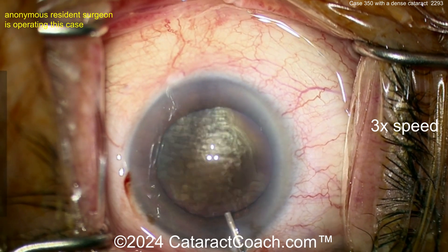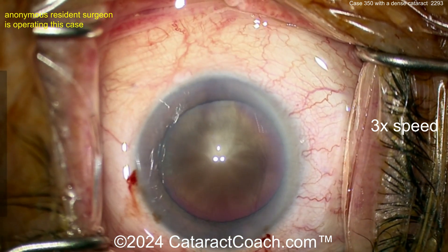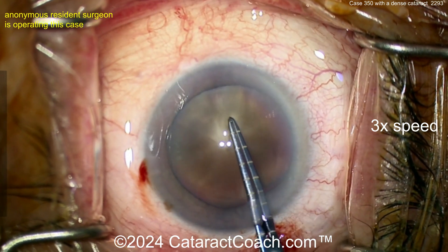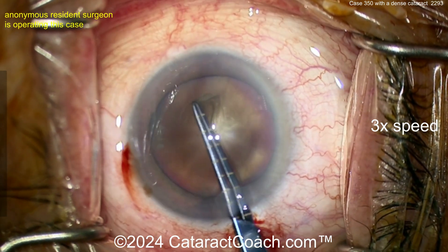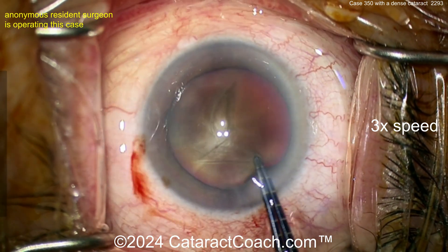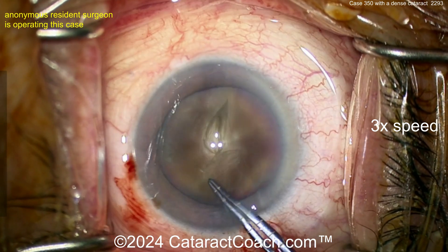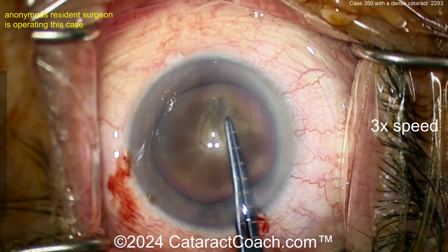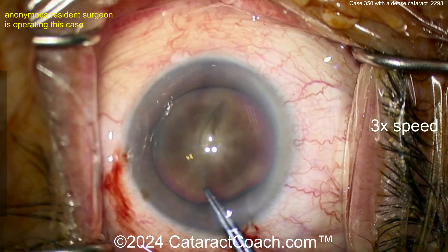Nice incision there. Here's the viscoelastic — you may want some trypan blue dye just to get better visualization. I like your forceps; they have marks at every millimeter so you can judge your rhexis size. My forceps have marks at two and a half and five millimeters. Getting a nice, good, generous rhexis — I like this. Don't make a baby rhexis. Let's get a five-and-a-half millimeter rhexis easily.